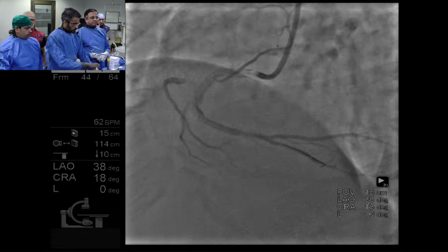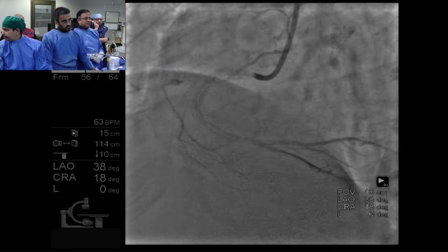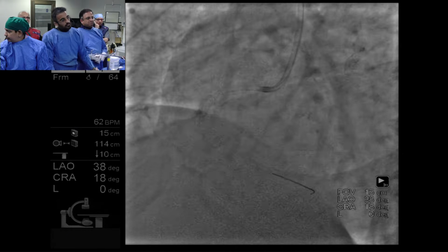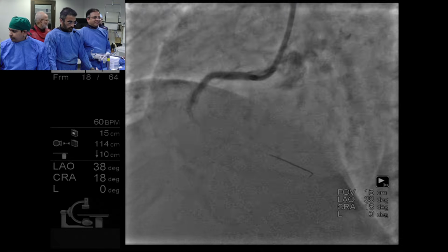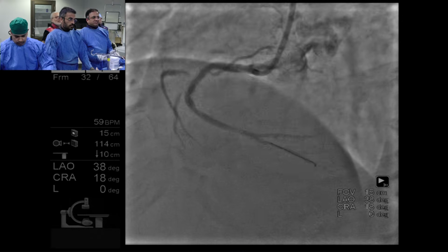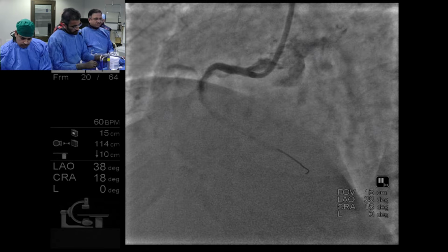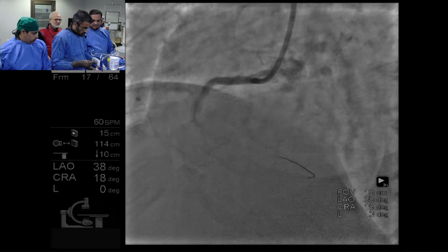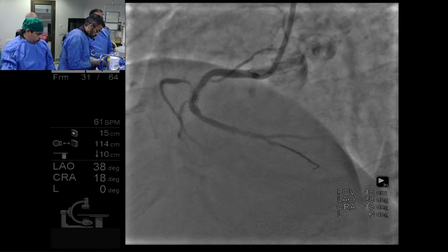Samir, there is a large branch coming out of this thing. Absolutely. You want to wire it, do a small pre-dilatation over there? It's likely to close. It probably will, but I don't think we can properly enter it and treat it anyway. It has an awkward angle. It's inside a stent, and probably there is calcium. And moreover, it's just a going to say, extremely good ischemic preconditioning. Exactly. 99.9% usually leads to precordial ST elevation if it has sluggish flow like this, and here we don't see it. So it's probably already compensated for.